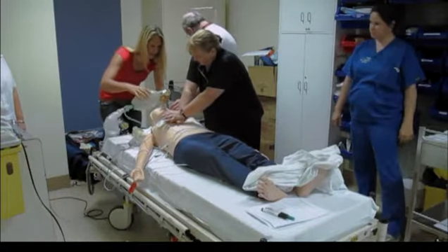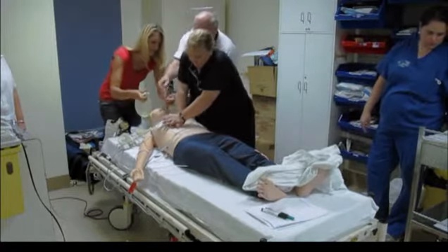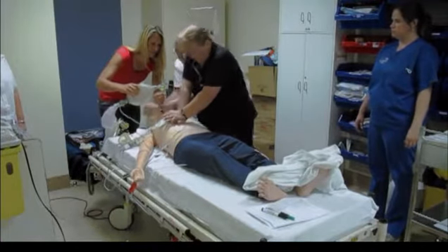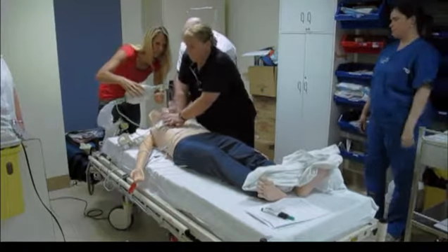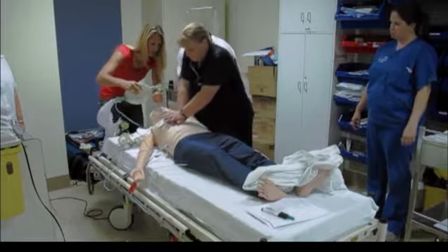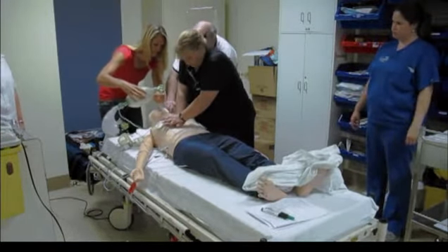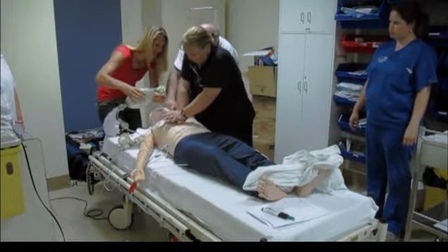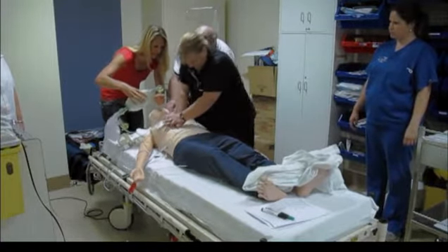That's in. I have the CO2, please. I'm going to do 10 breaths a minute as we're intubated, and I'll continue that while Sue is doing compressions. To note down the lip level of the tube. Tube is 23.